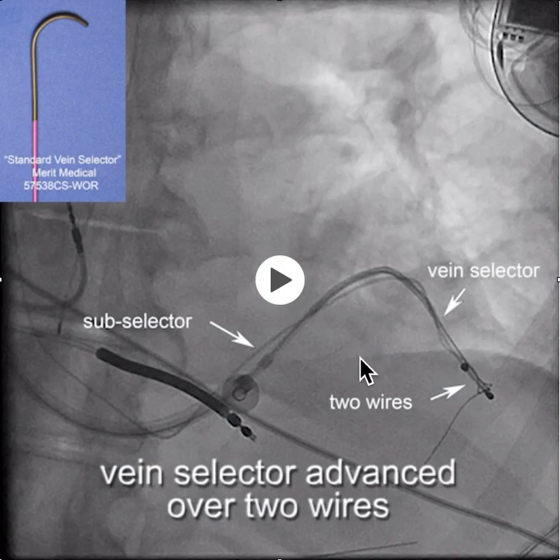The V18 wire makes something like an Ironman seem like a wet noodle. It's a very helpful wire to provide support over which we can advance the vein selector deep into the target vein.